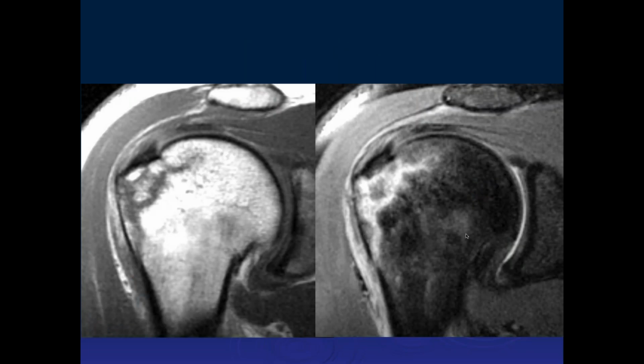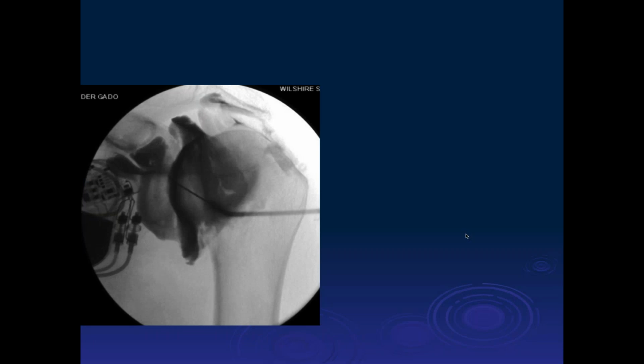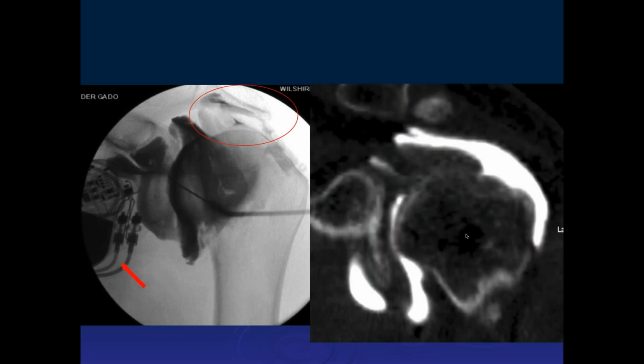Okay, Thomas, what do you think of this case? Before you answer, do low field scanners, are they a little less dangerous? There's been a lot of debate about that, and the general feeling right now is the low field scanners probably aren't any safer than high field scanners when it comes to electronic devices in the scanner.